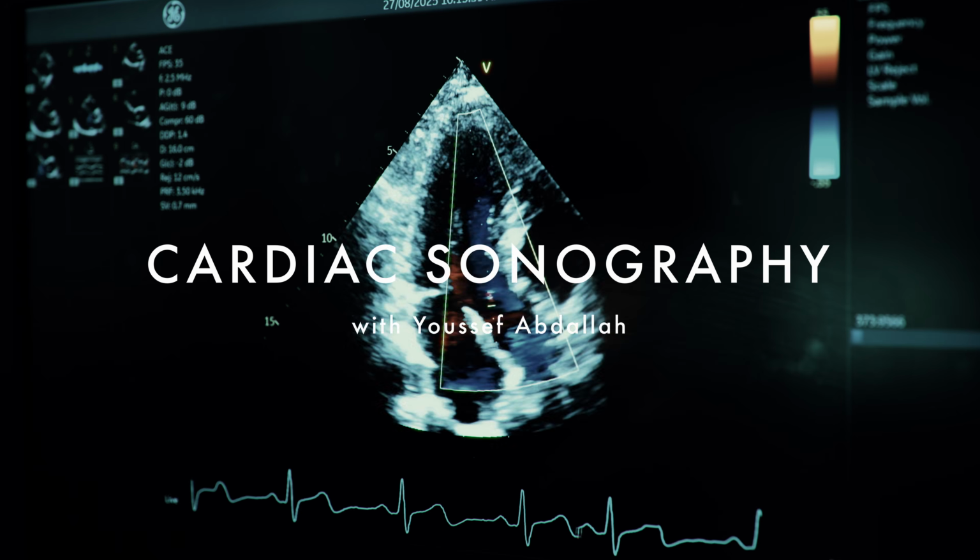In today's episode, I'm going to be teaching you how to do a transthoracic echocardiogram, the full scan. We're going to go through all the protocols and windows and measurements. Your foundation is going to be based on this entire video. So let's get into it.